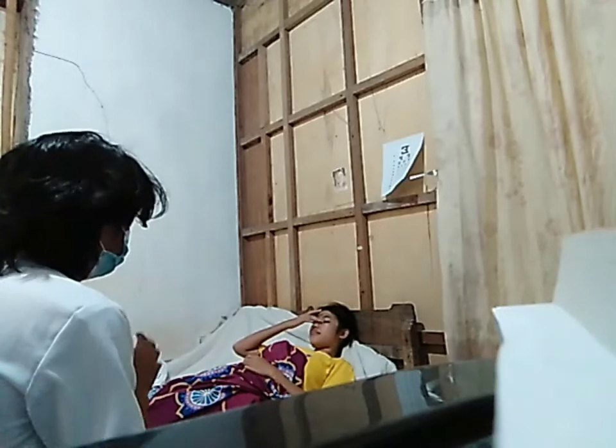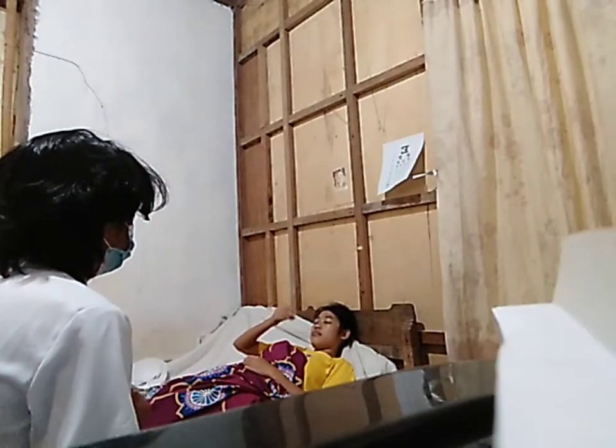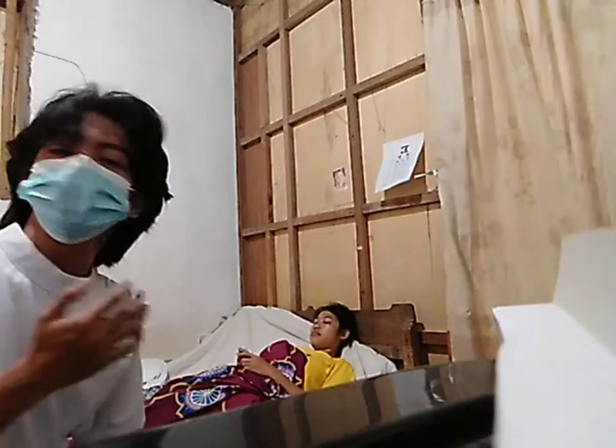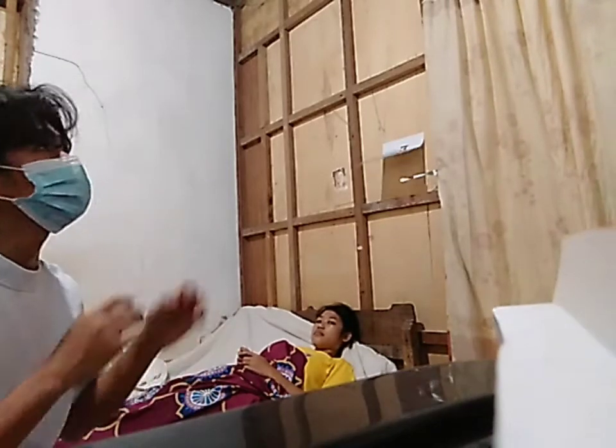So sir, you will feel discomfort, so that's okay, sir, because this will help you in urinating, sir. So is it okay to you, sir? And also I will expose your genital. Is it okay, sir? So okay. And after that, provide patient's privacy.